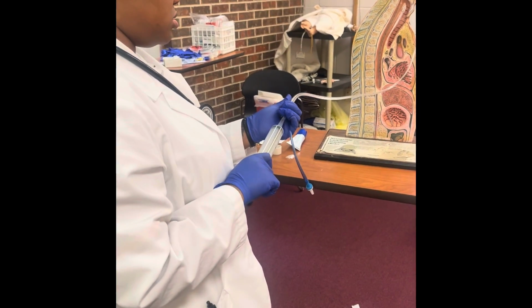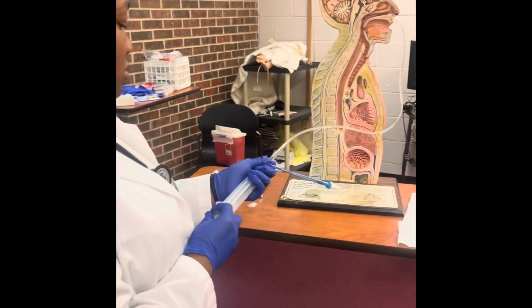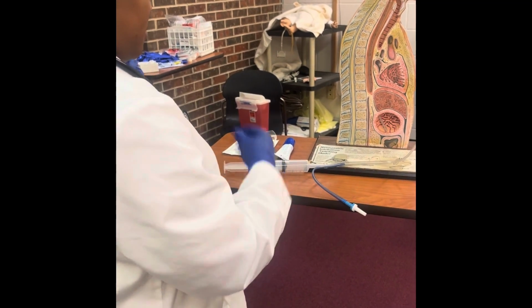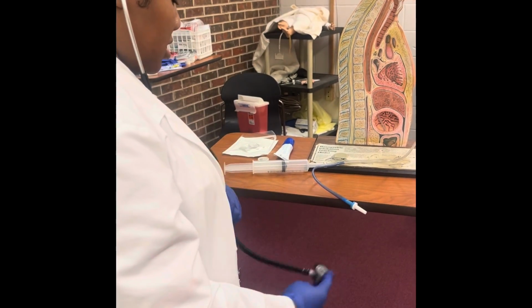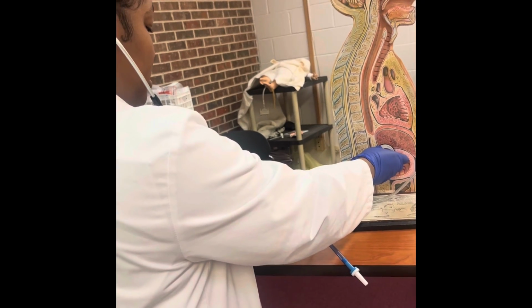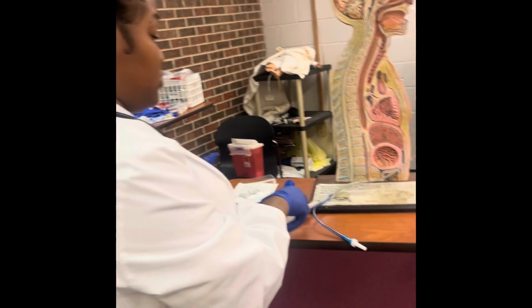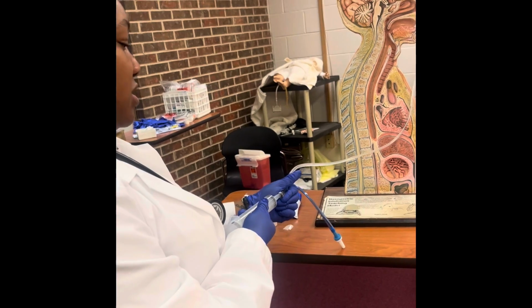And then to make sure that it's in the right spot first, I'm going to connect this to the tubing because I'm going to pull back and see if I can get some residual, some stomach contents, which I do. And then as I push back, I can listen to make sure it's in the right spot as well. I should hear some bubbles or some air. And then while he has his NG tube on, I will be checking his residual continuously throughout the shift and every day. And if it's over 100, I would hold feeding.